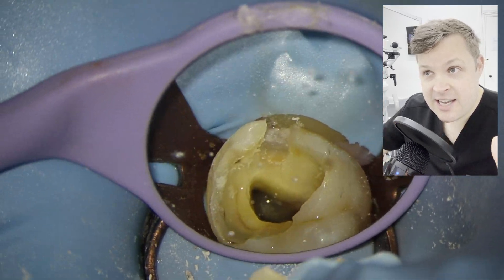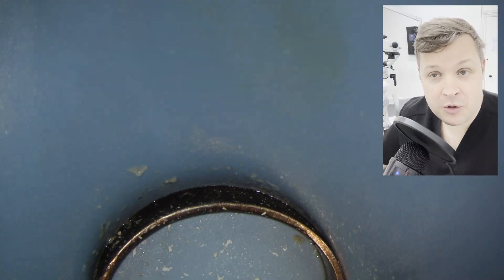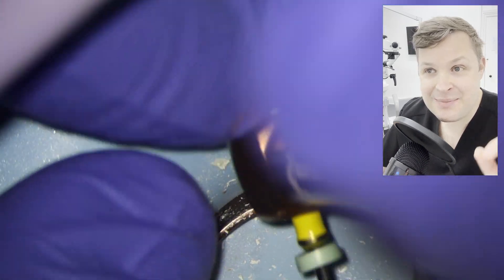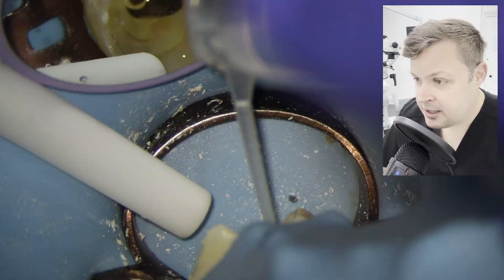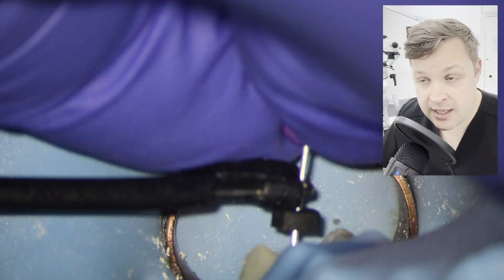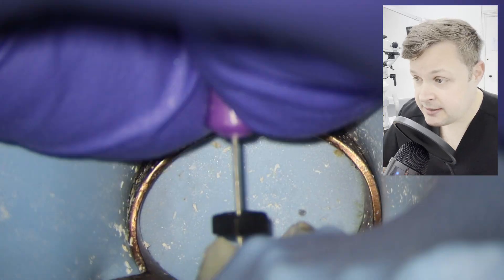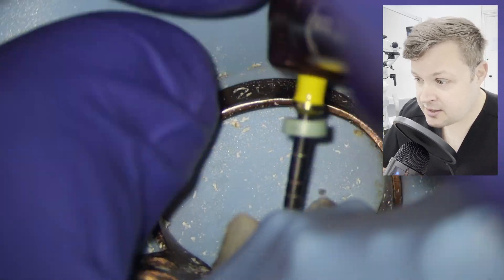Also, when you take an x-ray — say an amalgam — a little tiny piece falls down, you'll see these pieces and it's super annoying, especially if you're a perfectionist like me. So the video today is not going to talk about shaping the normal canals. This is an upper six, by the way — the mesiobuccal, distobuccal and the palatal.